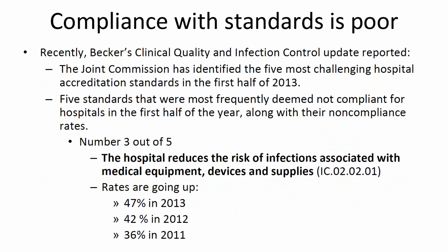Now, Becker, along with many other publications, have published information about compliance and what's going on with it. As we know, whether it's Joint Commission or AAAHC, whoever you're using, they are coming in more and more and looking at your sterilization, your cleaning process. And if you look at this slide, notice 2011, 36%, 42% in 2012, 47% in 2013. I don't have 2014, which will be out soon because it takes time to get this. But where are they looking? They're looking at your cleaning, sterilization. What are you doing? How are you doing? Are your IFUs there? So the surveyors are focusing on this area. Next slide, please.